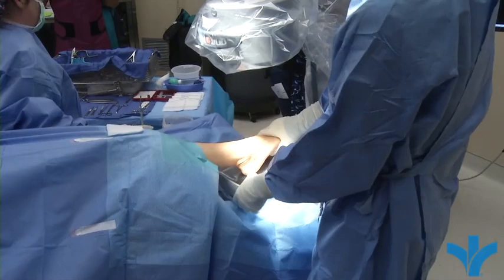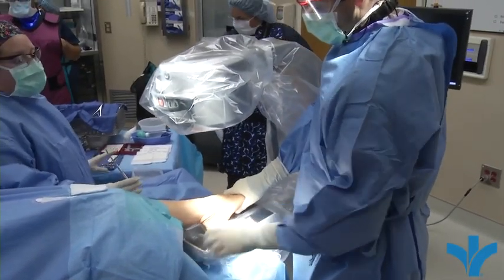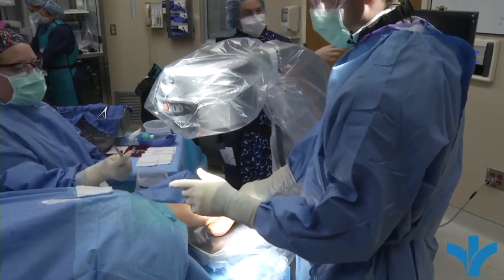This is called a mini C-Arm. It puts out a lot less radiation than big C-Arms do, and it's a lot better for the patient and for the team in the operating room.